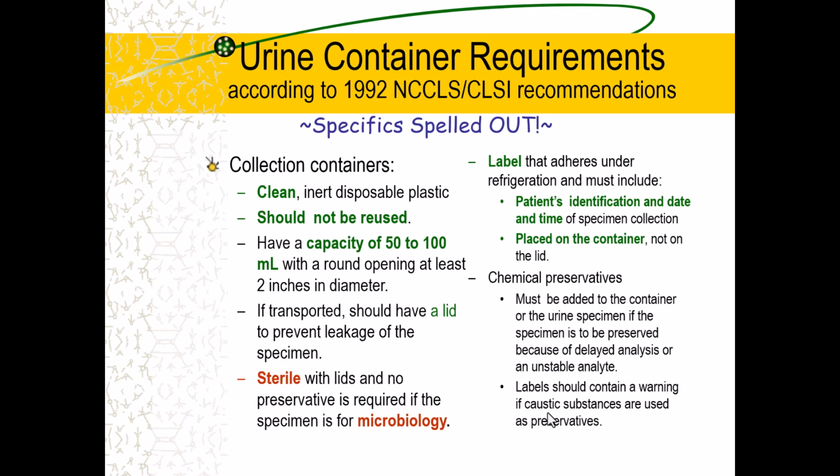Anybody that's ever gotten a urine in the lab knows that we have not figured out how to do that yet. It's ridiculous, but yeah, they all leak. They must be sterile with lids. They must be labeled with a label that adheres during refrigeration, and it must be on the container, not the lid, because lids can get mixed up. The urine is in the container, so the container must always be what is labeled.